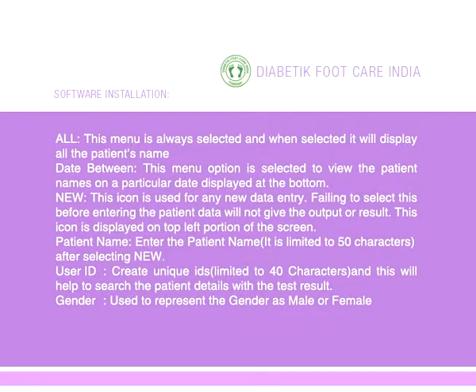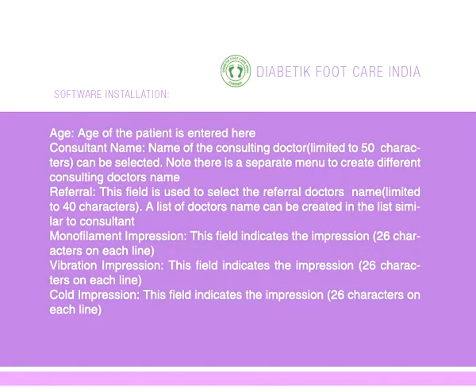test result. Gender. Used to represent the gender as male or female. Age. Age of the patient is entered here. Consultant name. Name of the consulting doctor, limited to 50 characters, can be selected. Note, there is a separate menu to create different consulting doctor's names.